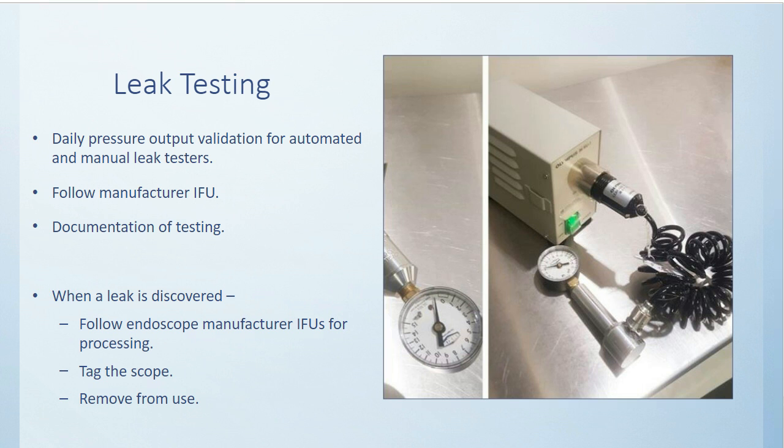Emphasis is given in this new document related to daily QC testing and documentation of pressure outputs from leak testers. Because if the leak tester is not supplying adequate pressure, leaks can be missed. Next slide, please.